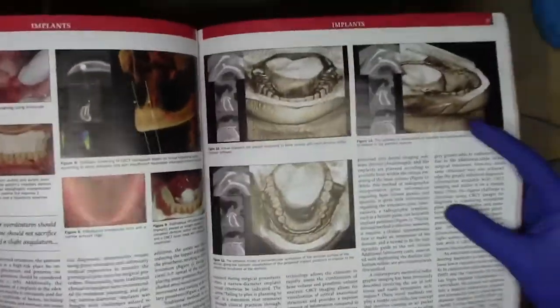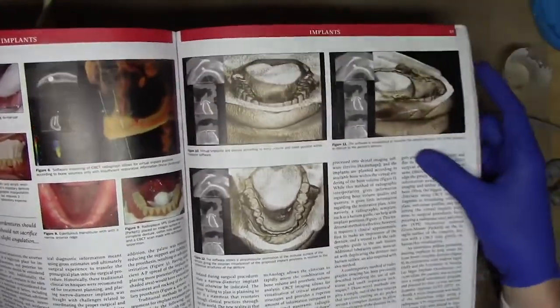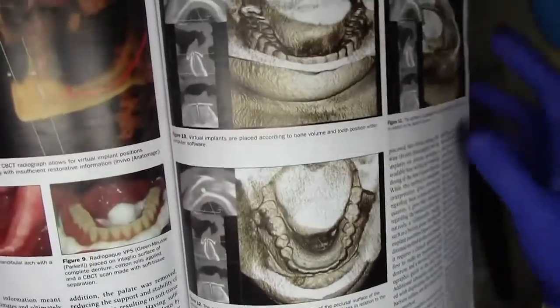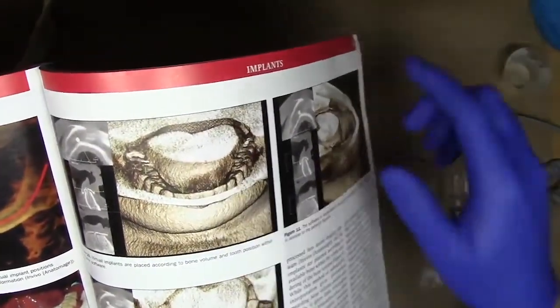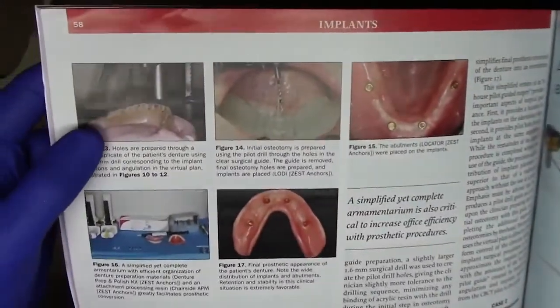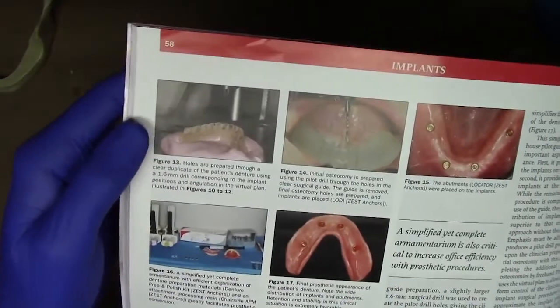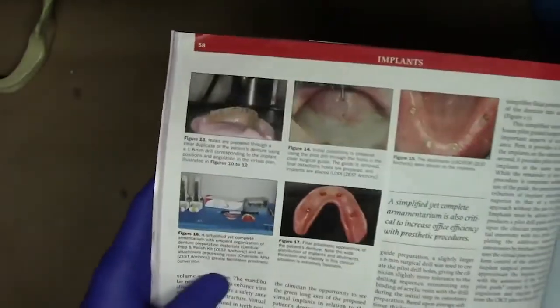But what's most important is these 3 steps of where I get to know exactly where my holes are going to line up. As you see here on my patient's cone beam scan, I can see the frontal profile as well as the occlusal direction of where my 1, 2, 3, 4 green dots are, and also my approximate angulation, and also from a side direction. And what we do is we take it to a drill press, just like so, on this little putty table with the surveying table, and using my Zest 1.6 millimeter drill, punch a hole at those 4 locations.